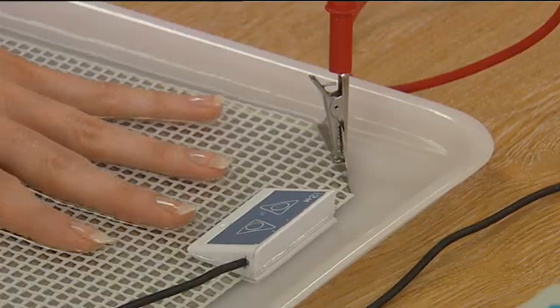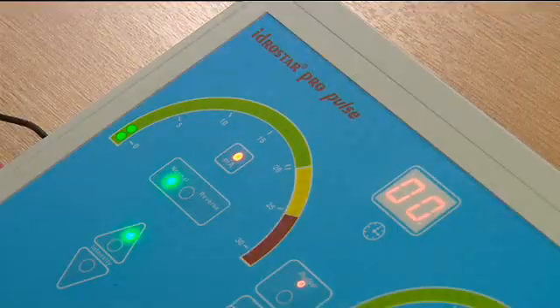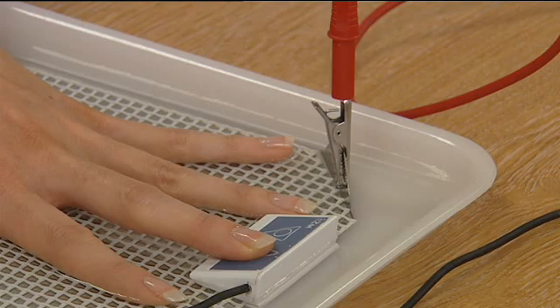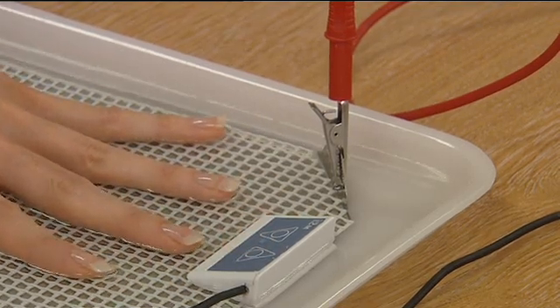Without taking hands out of the water, increase the current slowly by depressing the upward arrow on the remote control to the maximum level tolerable. At a certain level, a slight discomfort or pricking will be felt. Ensure that the current is not turned up too much.